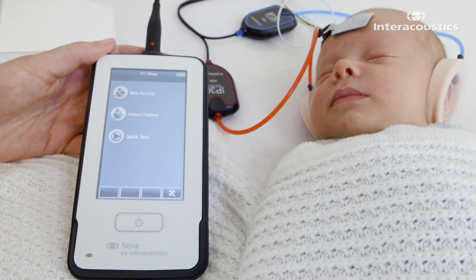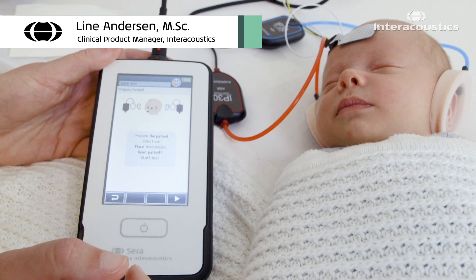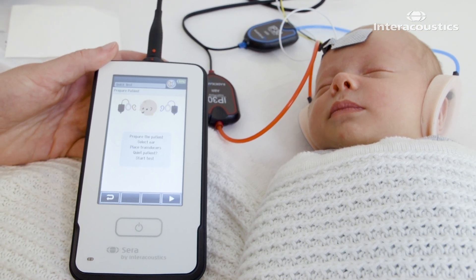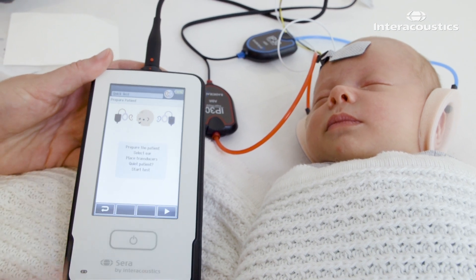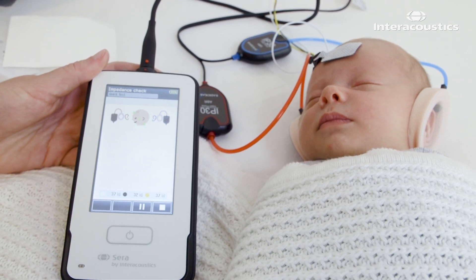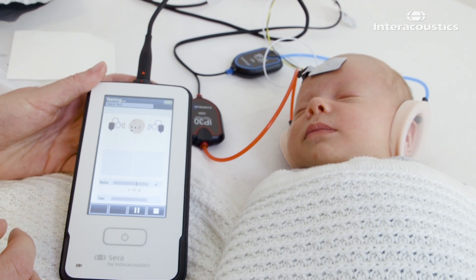Once your electrodes and ear cups are in place, you select a test on the Sera. We have our 35 dB CE CHIRP protocol. Press start. The protocol will automatically start once the impedances are within the normal range, and test binaurally.